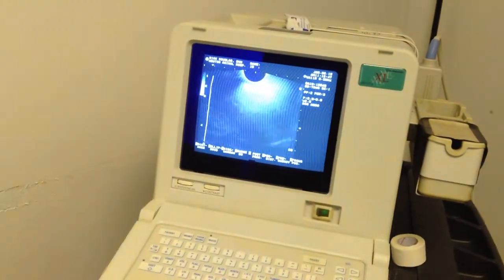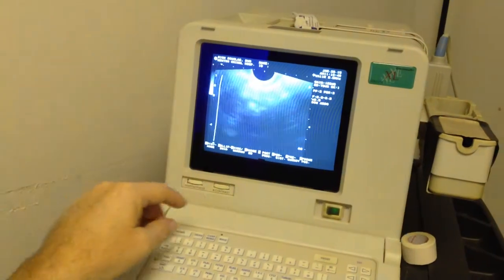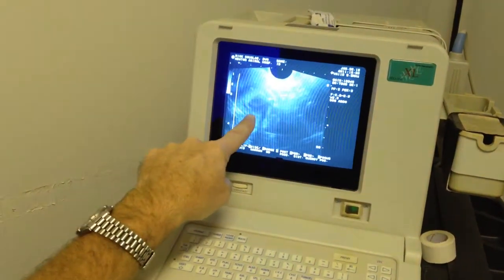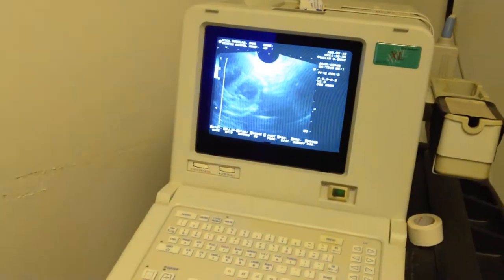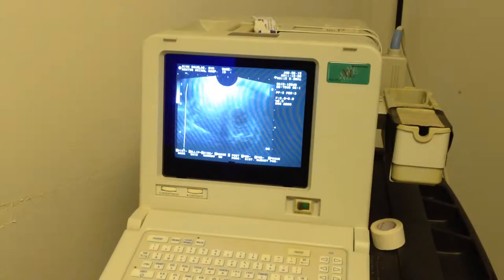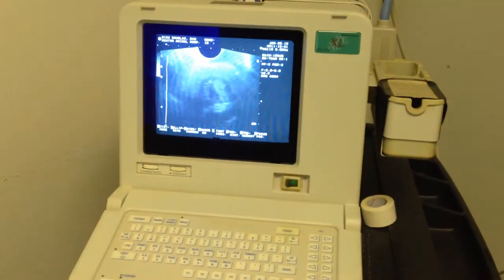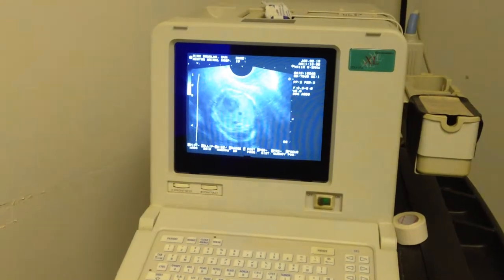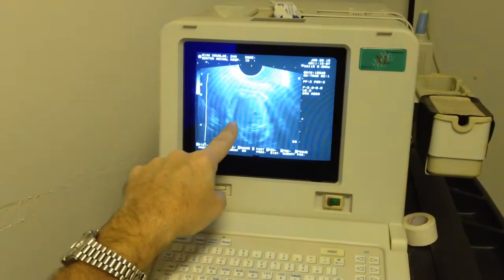Where is the hump? Oh, right there. Here we go. Right there. See that? Right there. And it's good, right? That's good. There's the other one right there. It looks pretty good. Right there.